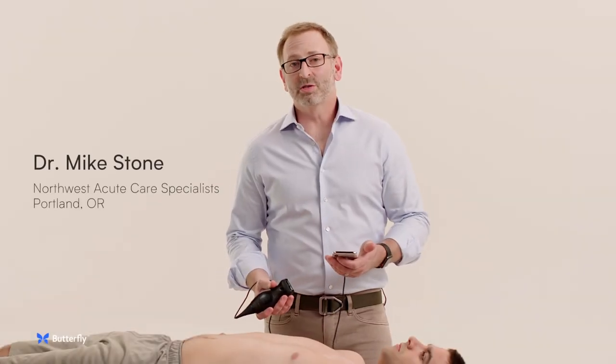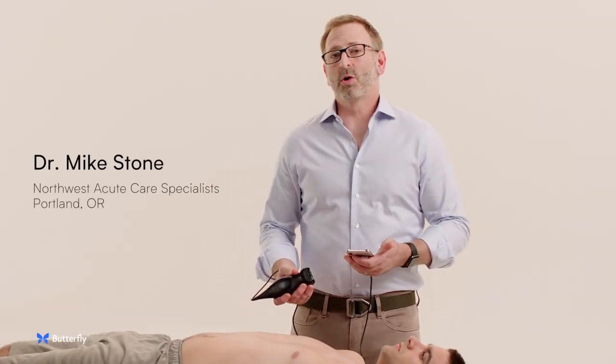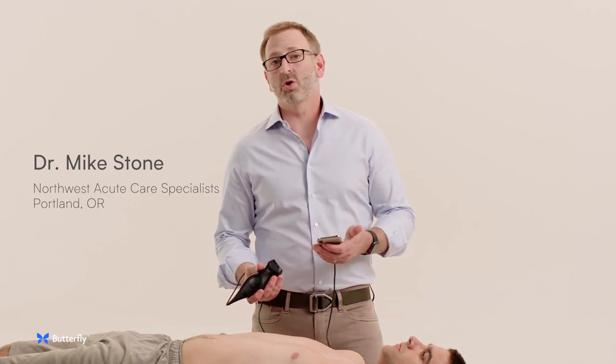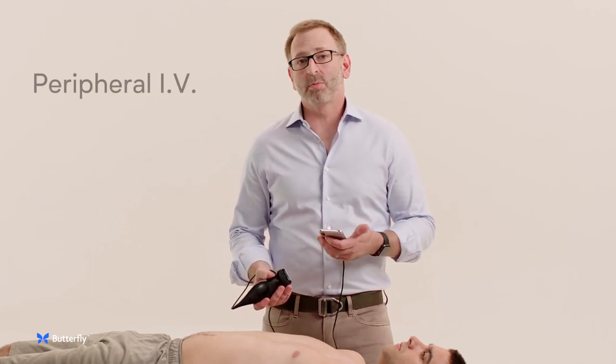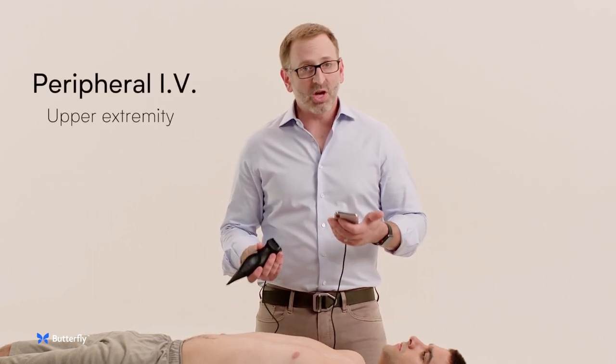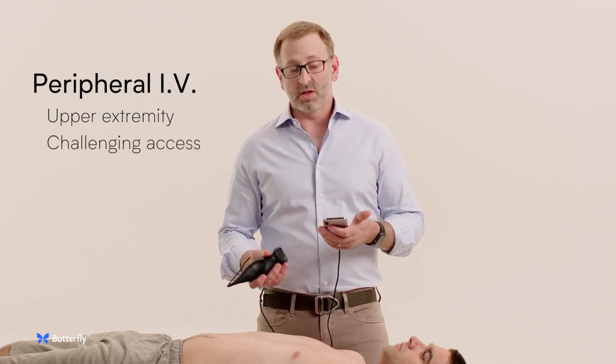Hi, I'm Mike Stone. I'm an emergency physician and a point-of-care ultrasound specialist, and I'm going to show you how to identify peripheral veins in the upper extremity for patients with challenging IV access using the IQ.